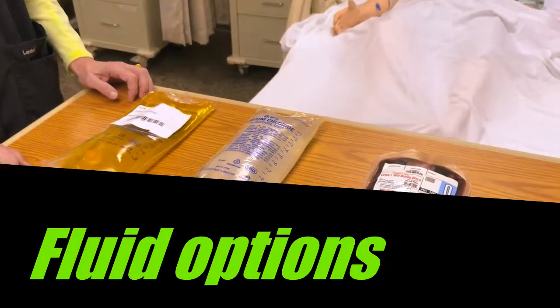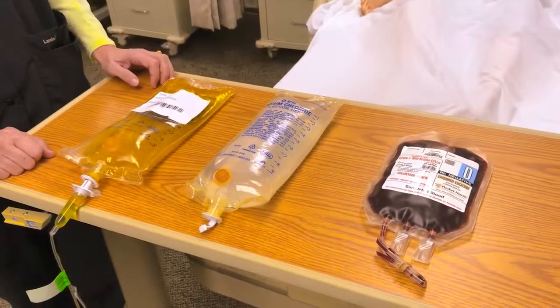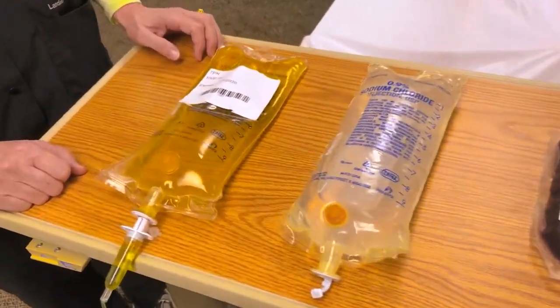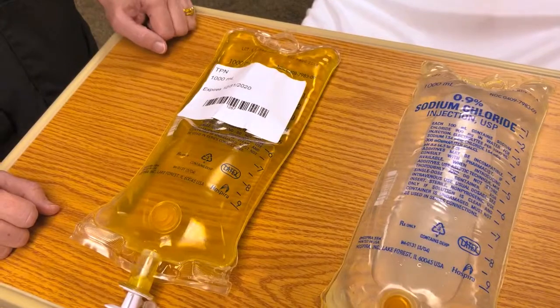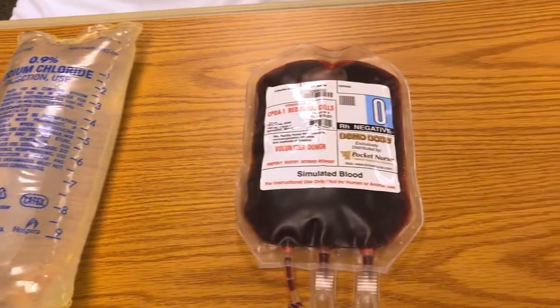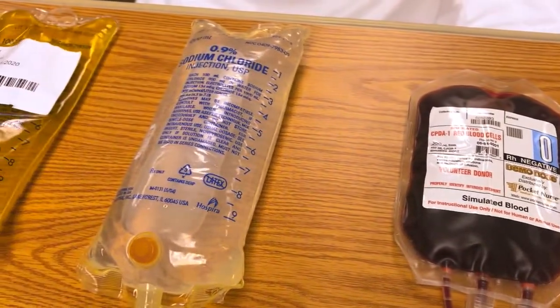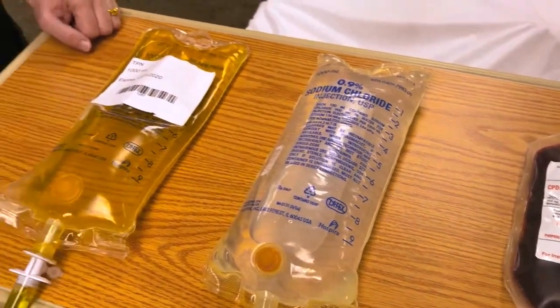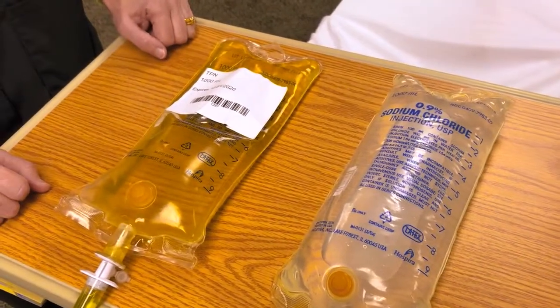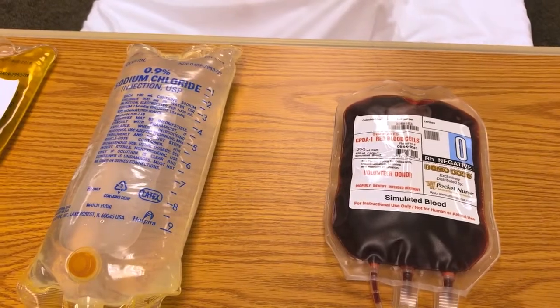Most manufacturers of the high fidelity or advanced simulators recommend administration of distilled water only. So the simulated IV bypass system allows you to administer any number of fluids, anything from blood products to TPN to normal IV fluids.